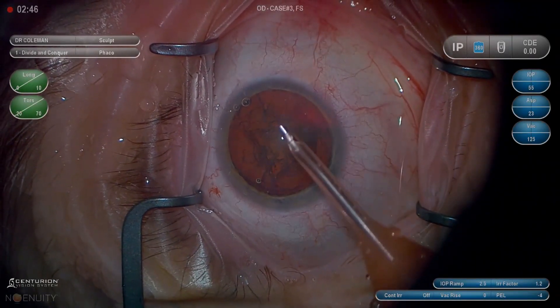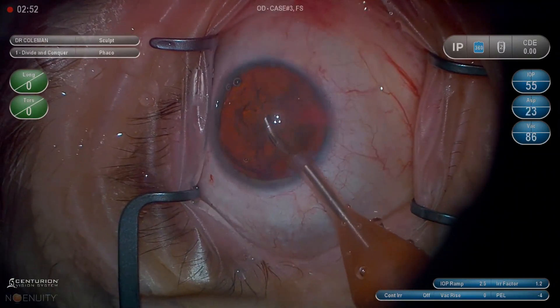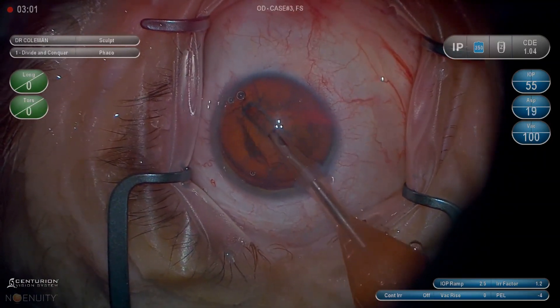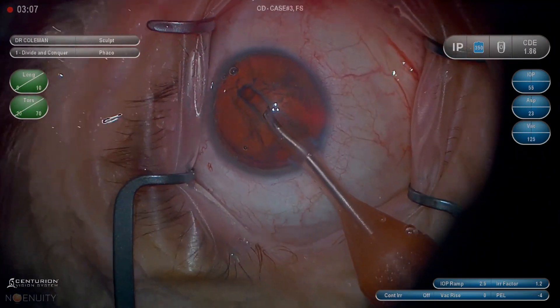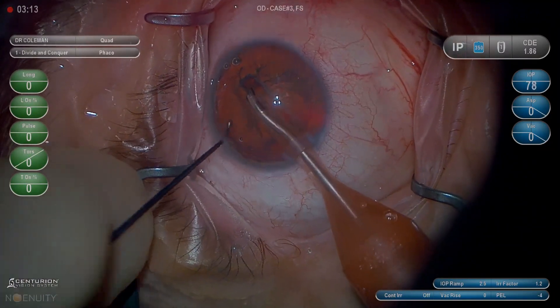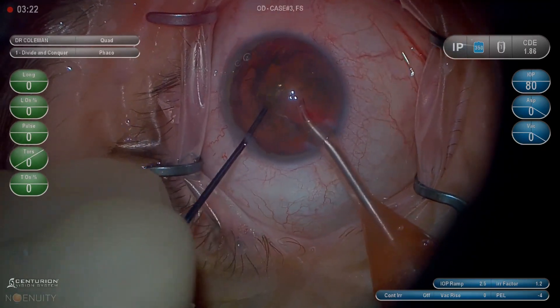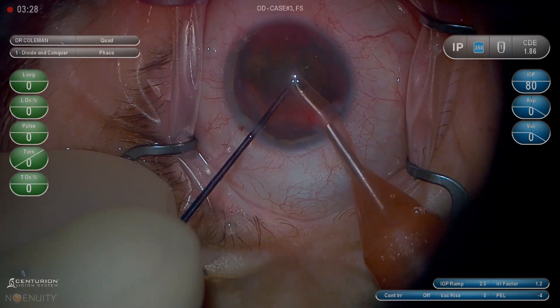Dr. Weich Coleman, this is Cataract Basics video 4 of 6 — nucleus extraction. This one's kind of long. Some of the other ones we've been a little bit pressed for time and I've talked through them quickly. With the nucleus, it's about 80 to 85 seconds on average per nucleus removal, just under a minute and a half. I'll be talking not necessarily in the order of what you're seeing on the screen, but in general about the concepts you're going to see played over and over. My preferred method is divide and conquer, a modified divide and conquer.